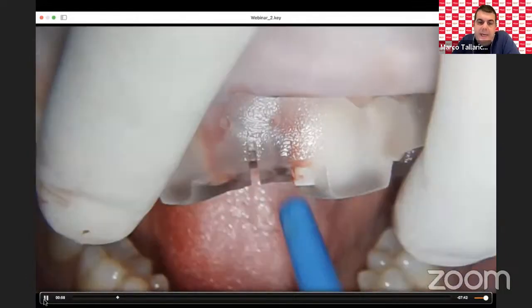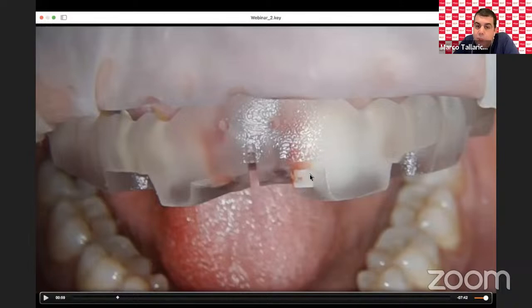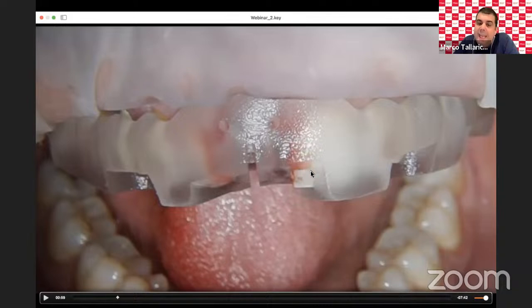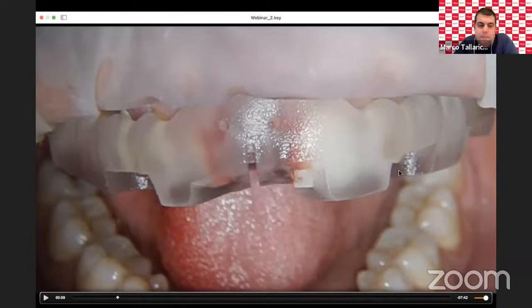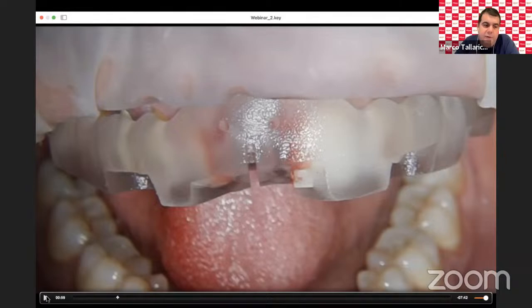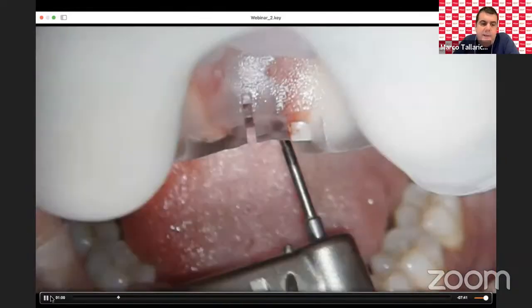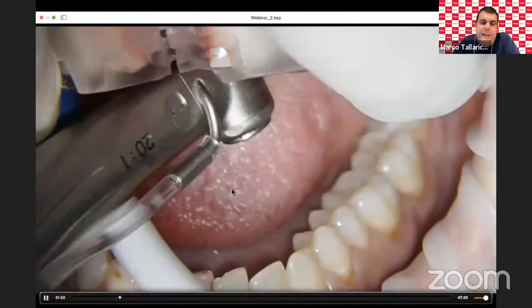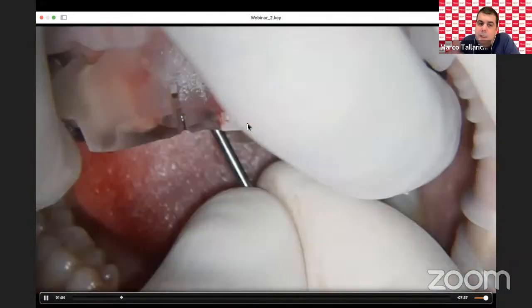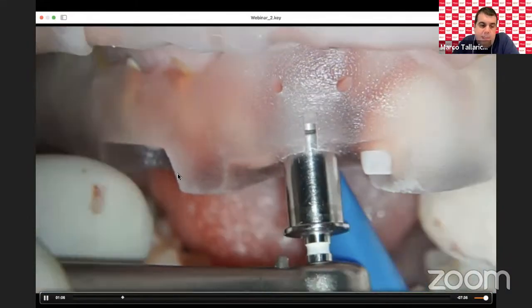There are three inspection windows — one close to the sleeve, one mesial, one distal — so I can be sure the guide fits well. Nothing appears between the guide and the teeth. I plan an anchor pin — one anchor pin in this case — and this is the first drill. In the next webinar we will speak about execution.